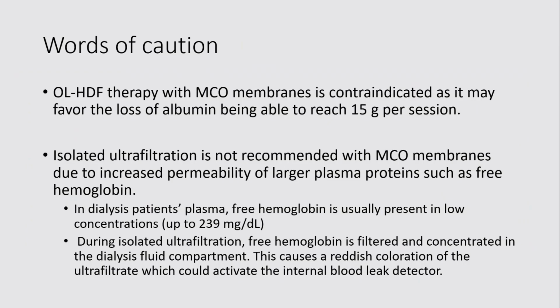The word of caution is that if you are using online hemodiafiltration, we should not use MCO membranes. These membranes should not be applied to a machine where online hemodiafiltration is done, because there is a risk of significant loss of albumin, up to 15 gram in each session. And isolated ultrafiltration should not be done with MCO membranes.